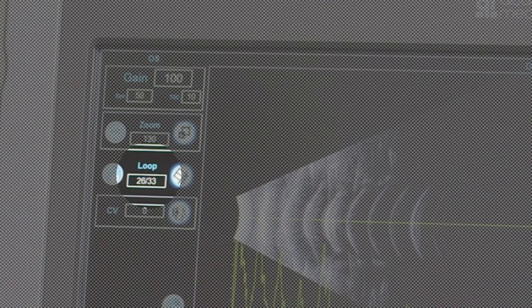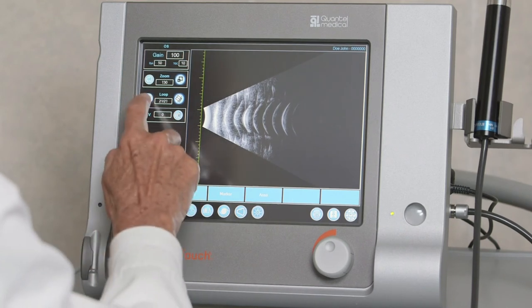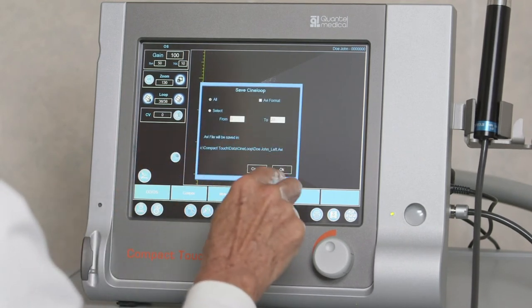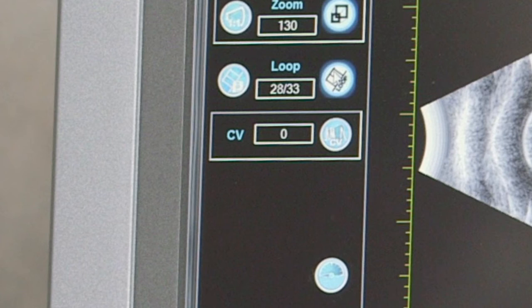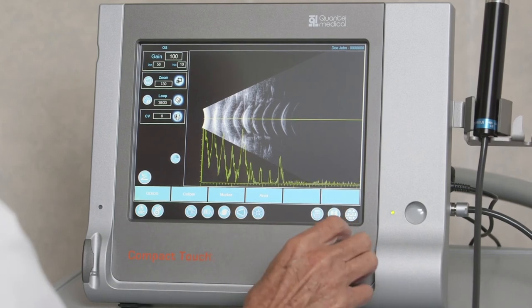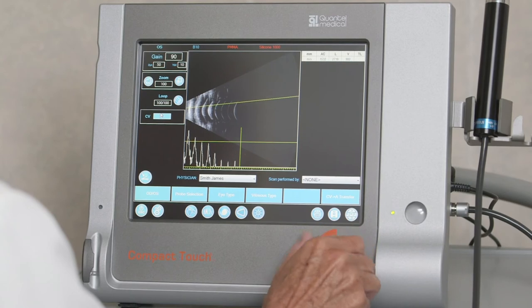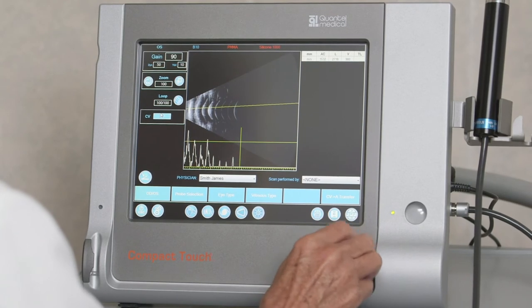The CineLoop function records a 10 second long video sequence corresponding to a maximum of 100 images and is activated with the CineLoop icon. The number of automatically recorded images is shown in the loop field and the sequence can be saved by selecting the loop save icon. Using the C-V function via the C-V icon on the left allows the examiner to add an A-scan cross-vector over the B-scan echograph. Changing the C-V value allows the examiner to move the C-V line up or down.